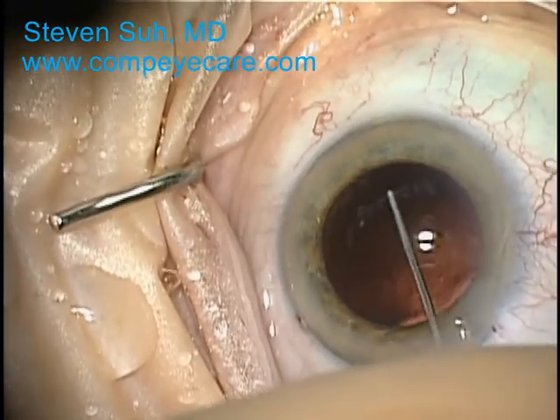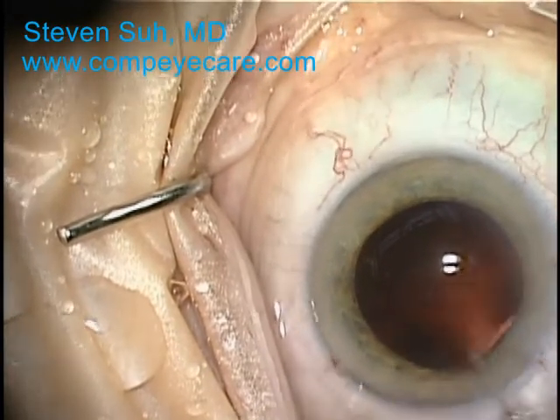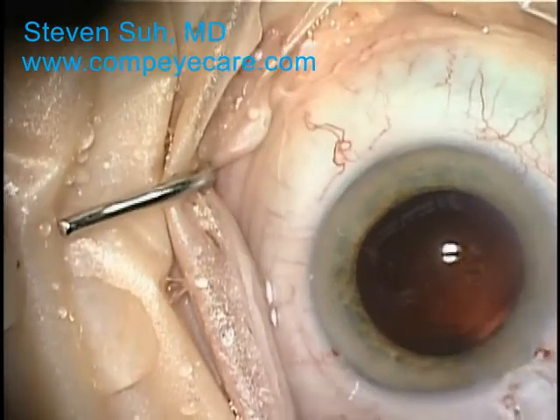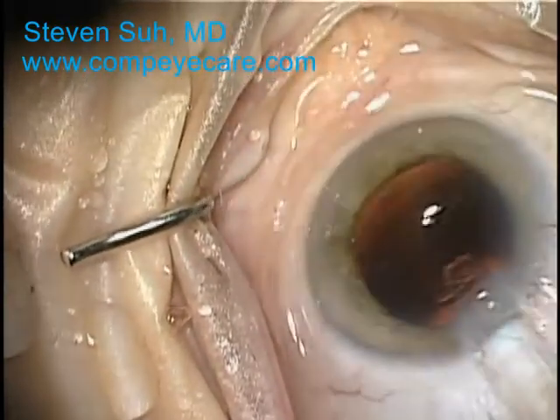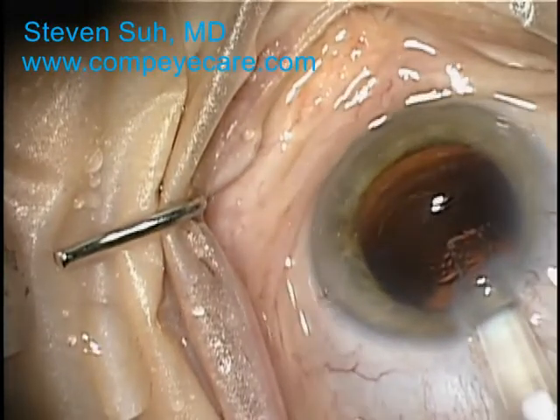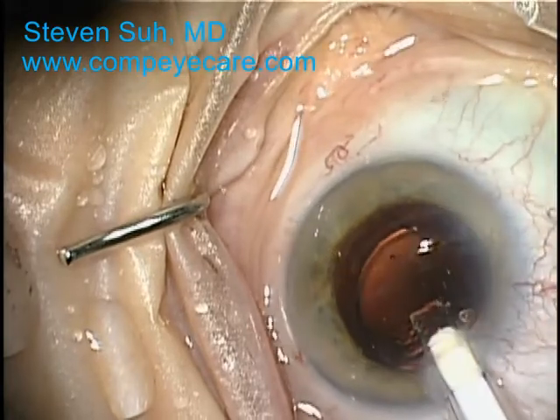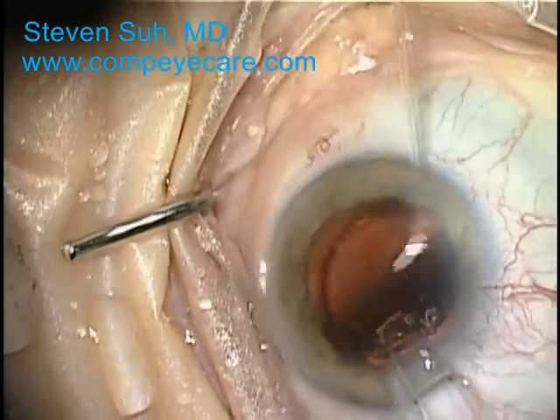I am injecting viscoelastic material into the capsular bag to inflate it so that the lens can be inserted without causing damage to this delicate lining. Here you see the tip of the cartridge of the IOL inserter. The artificial lens gets compressed in the injector and will open to its full size inside of the eye. This way we can keep the incision size small, which reduces surgically induced astigmatism.